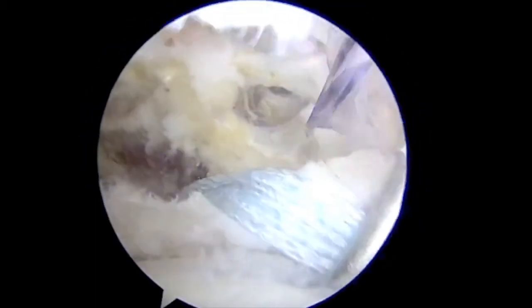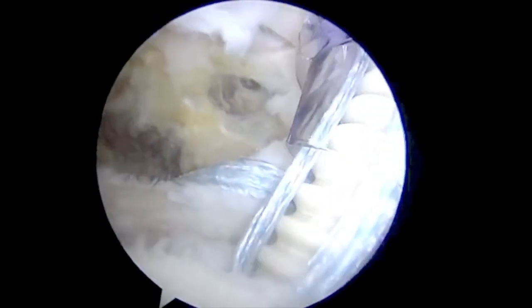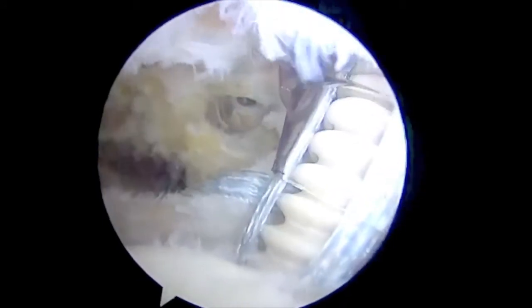A punch for the second anchor is made. The second 4.75mm swivel lock anchor loaded with fiber tape is placed at the superomedial aspect of the subscapularis tear. The suture is passed using a scorpion suture passer.